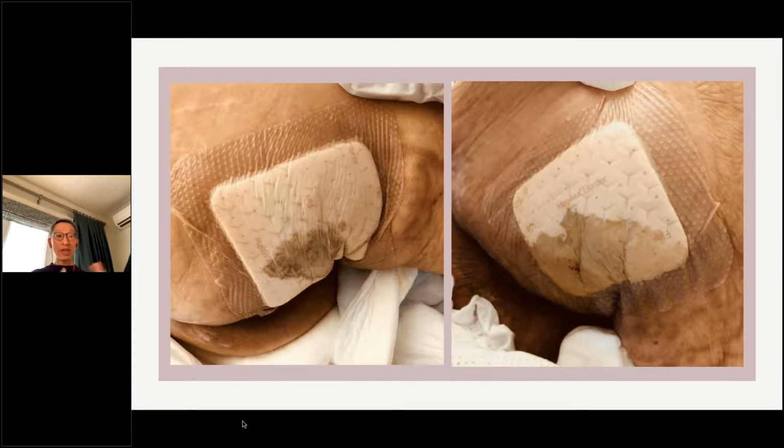So, of course, we had to change the pattern, and we did convince her to cut down the hours sitting in a chair. And also, we've been testing and trialing different types of dressing material. We've been very frustrated with the different materials in terms of the dressing's ability to handle the fluid. There's always leakage. And also, because she was incontinent, the urine is always seeping and leaking into the dressing. At the end of the day, the dressing is basically drenched, soaked with urine. And you can imagine the skin exposed to the urine for a prolonged duration of time, the potential damage it can cause, right? So that's why we thought, well, let's try the Flex dressing.